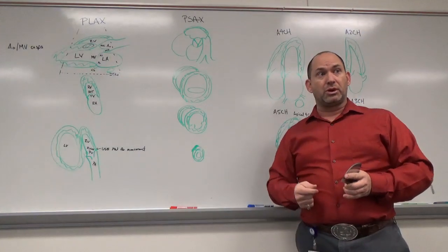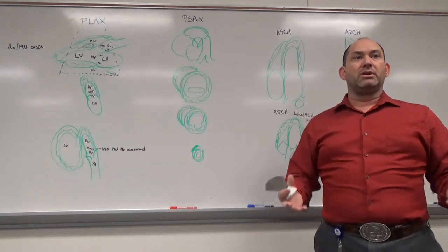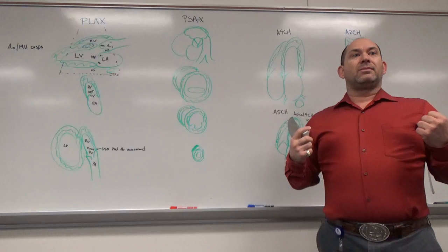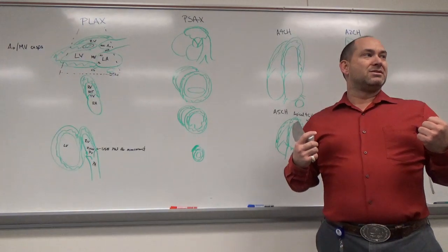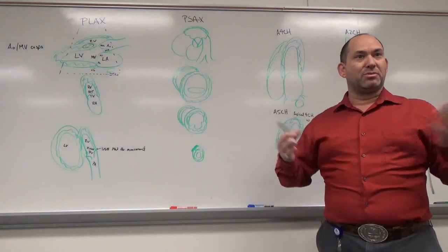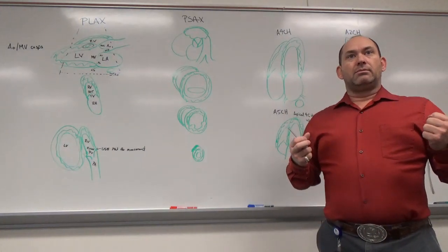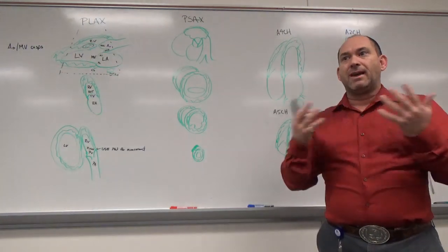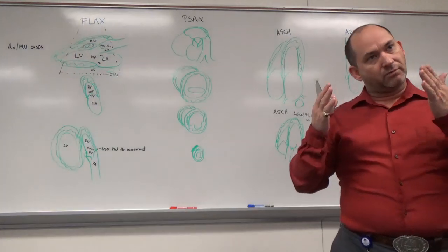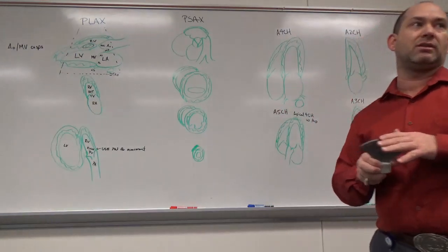You got to get your images quick, because the other thing is, they'll hold their breath. Everybody breathe in. Hold your breath. Okay, hold it there exactly for as long as you can. What do you notice you're doing? You breathe in, I hold my breath, and then I'm still holding my breath, but they relax their chest. That moved everything. So you've got a very short time frame. Your first couple of seconds are the prime time to get the stuff you need.